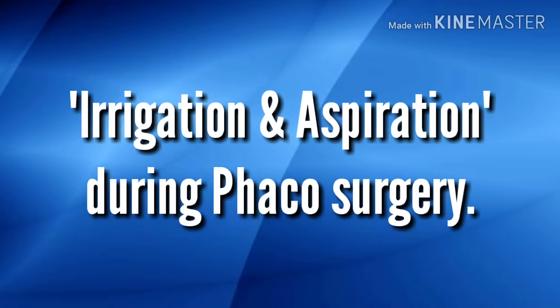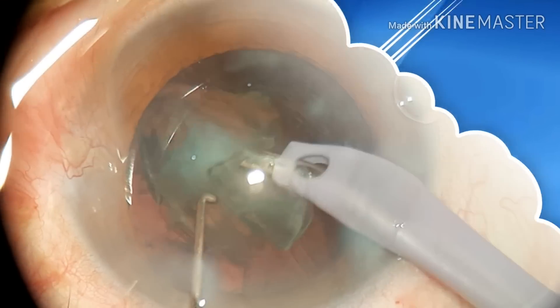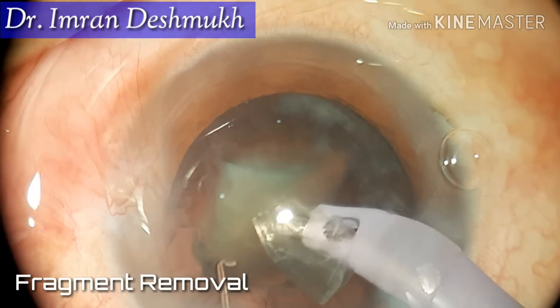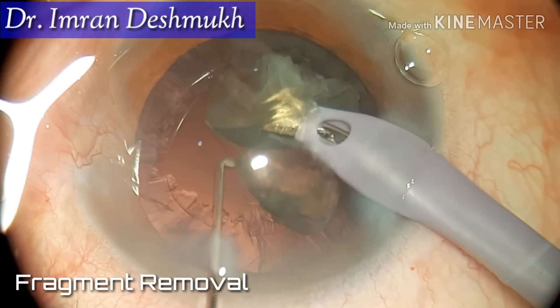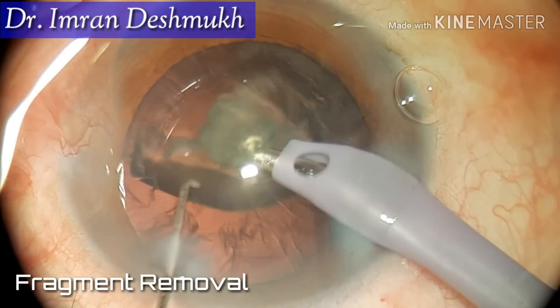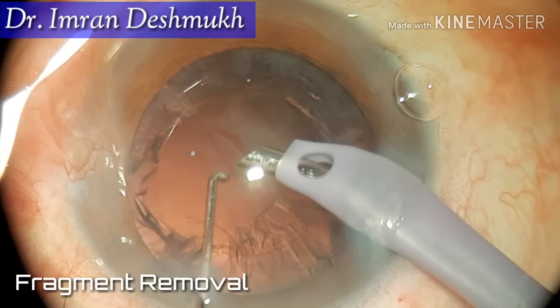Hello everyone, today we'll be discussing irrigation and aspiration of cortical matter during phacoemulsification cataract surgery. Last time we discussed fragment removal, and this time we'll be continuing with IA of the cortical matter.